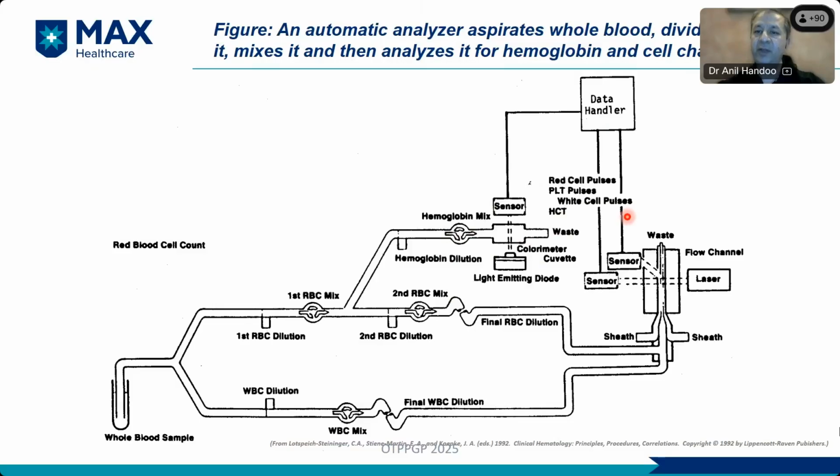Nowadays, in newer analyzers, they have eventually connected it back into a retic channel on this side, and then found out reticulocytes from the remaining RBCs, and also done a lot of work on the platelets on the retic channel. We'll not get into that detail at the moment.